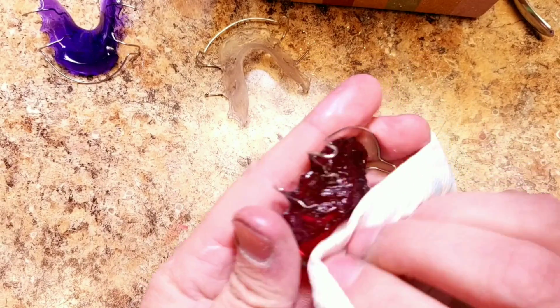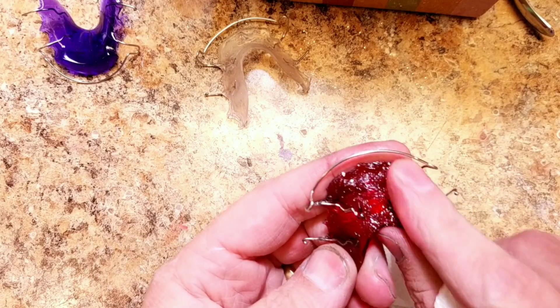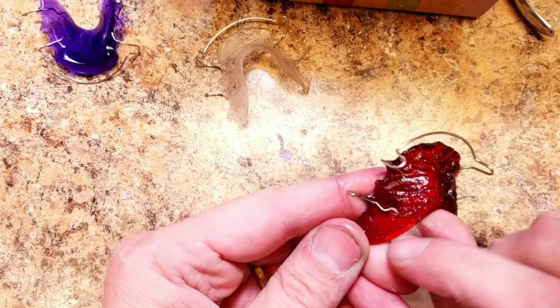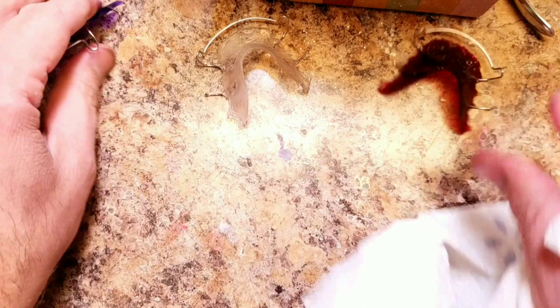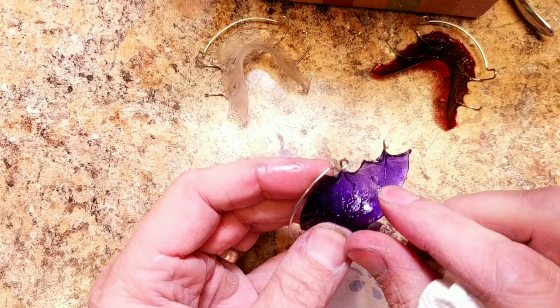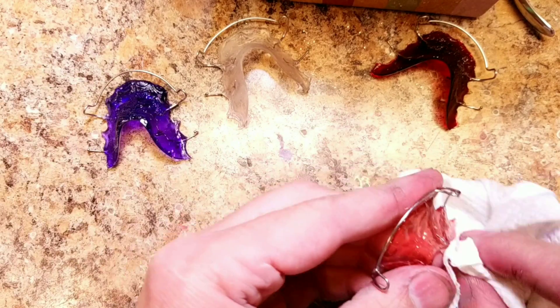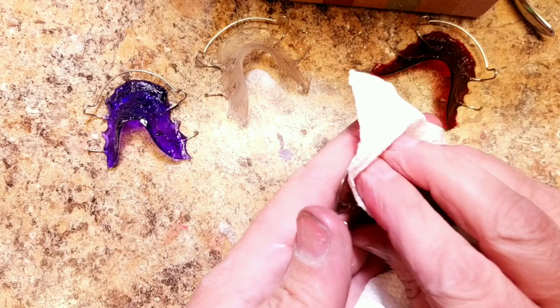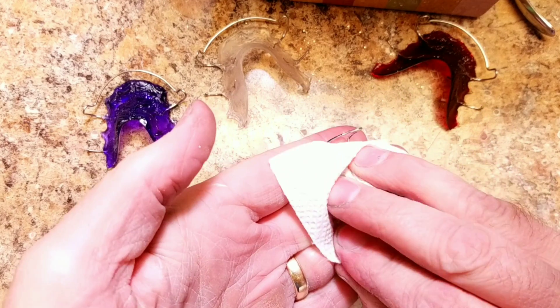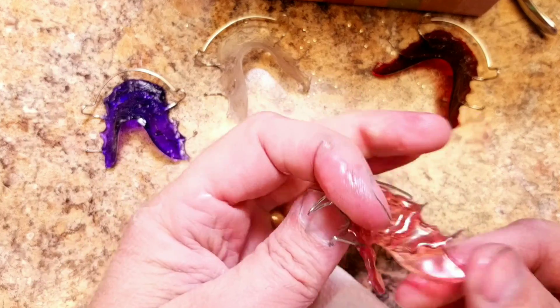What mineral oil is really helpful in doing is it gives you the final check to look for any bumps in the acrylic. When I was doing this one I felt a point right there - I'm going to take care of that before I send it out. This will give you a really nice, clean looking retainer.